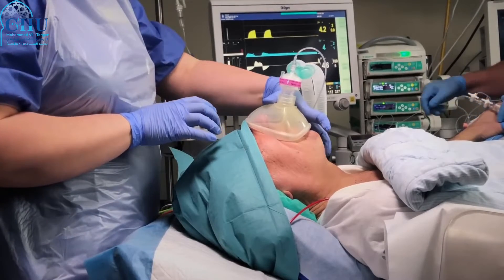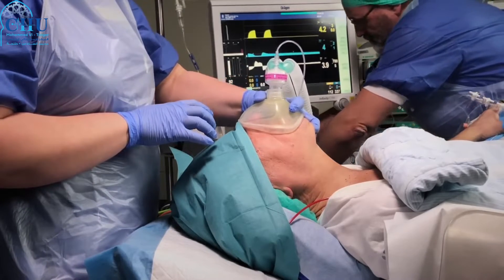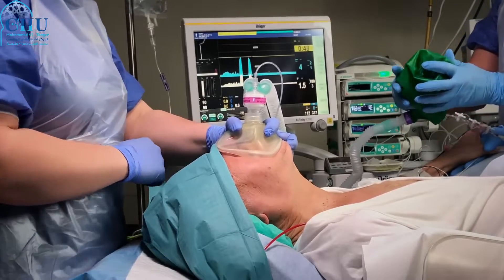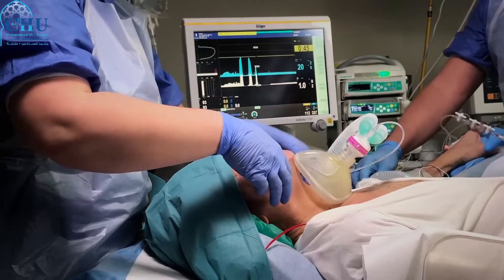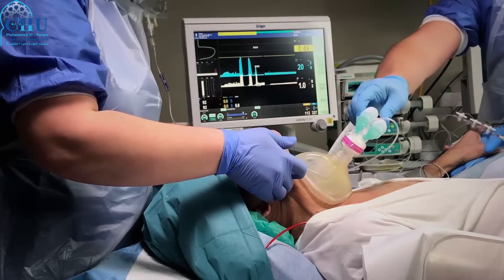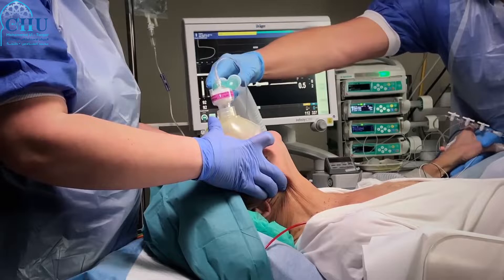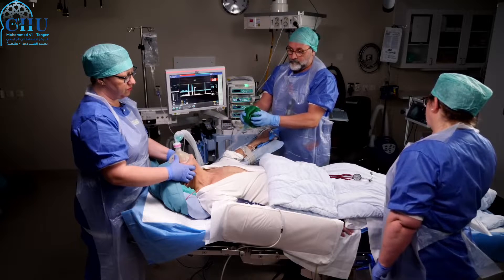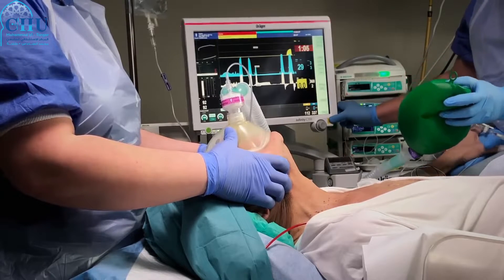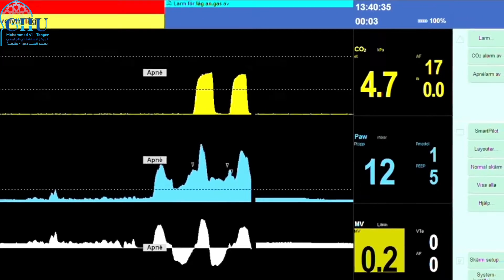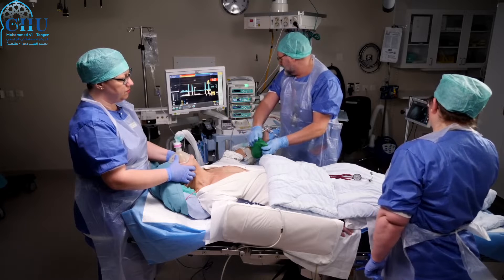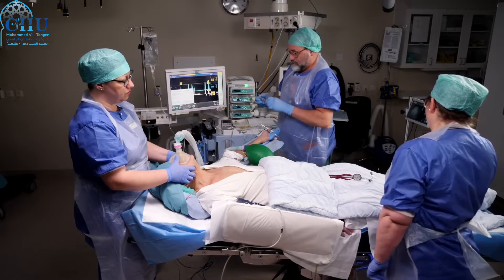Open the airways — a two-finger chin lift may be all it takes. If this isn't enough to ventilate the patient, the next step is a jaw thrust. Open the patient's mouth with your thumbs on the chin and place your fingers firmly behind the angle of the mandible, lifting straight up in a decisive manner. Successful ventilation is confirmed by observing the chest wall rising and regular end-tidal CO2 waves on the monitor. If you cannot ventilate the patient at this point, you need to use other equipment and techniques that we will demonstrate in forthcoming videos.